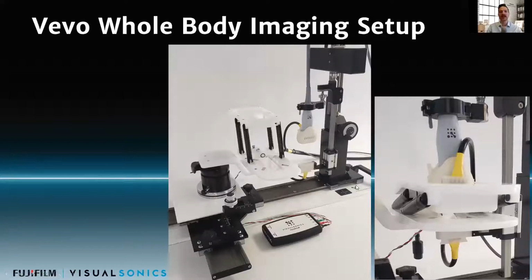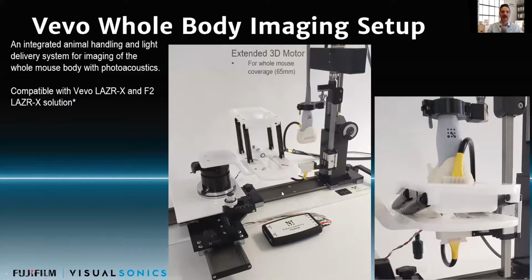And you'll notice that part of the innovation here is actually being able to deliver the light in a different way to generate those photoacoustic signals much more deeply in the animal and the tissue of the animal. So we're actually doing what's called trans and epi illumination. So we're illuminating from both sides and then collecting that data with our ultrasound transducer. And this just gives a more uniform picture of the animal and of the photoacoustic signal within the animal. It just really leads to a facilitated workflow if you're doing these, especially these repeat whole body scans.